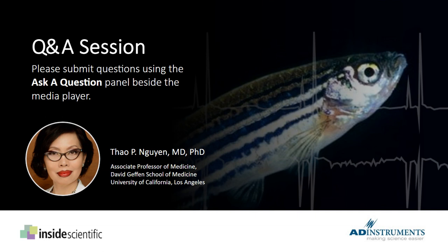But the relative proportion between the P wave and QRS is like that for that particular fish. So QRS is still the biggest, but you would see that a lot of times, as compared to humans, say, where the P wave is the smallest of the three ECG components, yes?